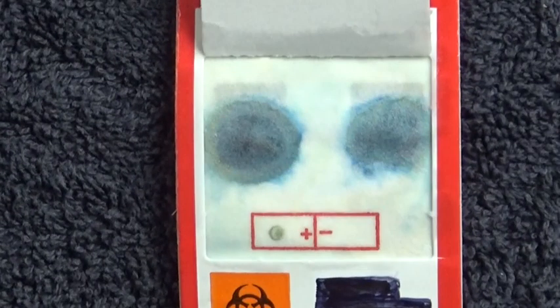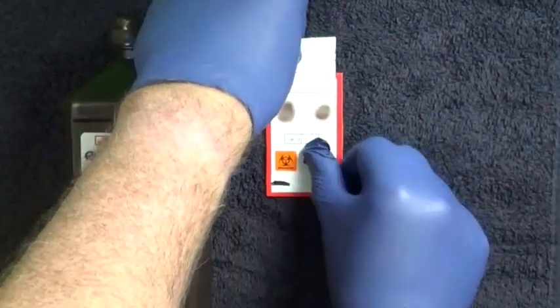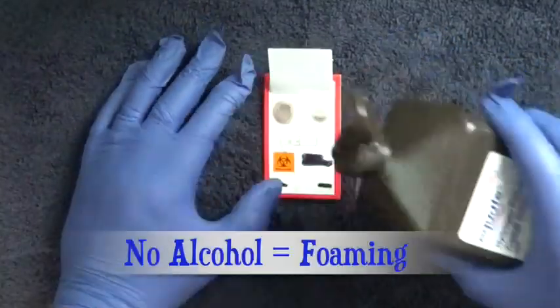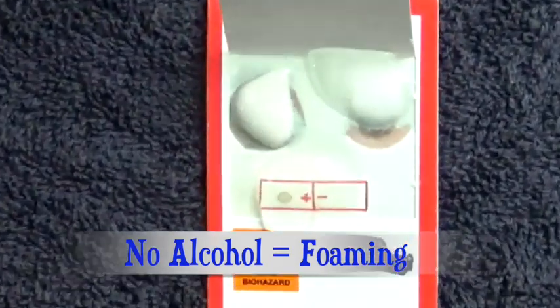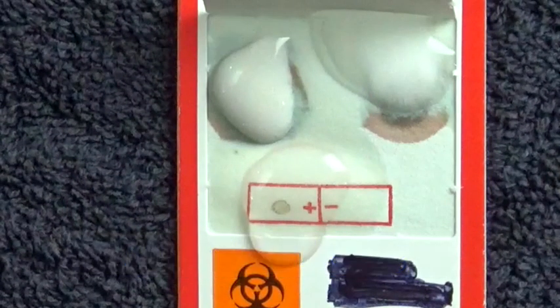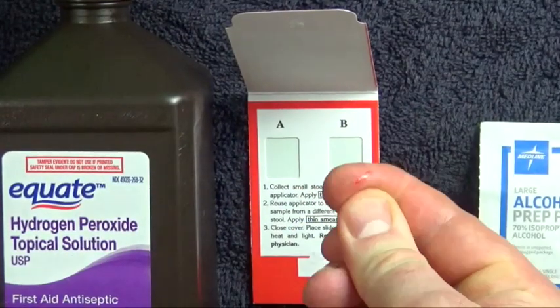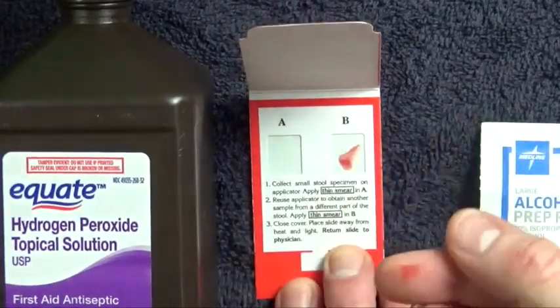There's that blue color. Now it still works without the alcohol prep, but not as well, since the peroxide foams up a lot more and you might have to squish down the bubbles a few times. The color change still happens, but you gotta remember to wait a full minute. So if you ever need to run a hemocult test but you can't find any developer, you can do the same thing yourself.